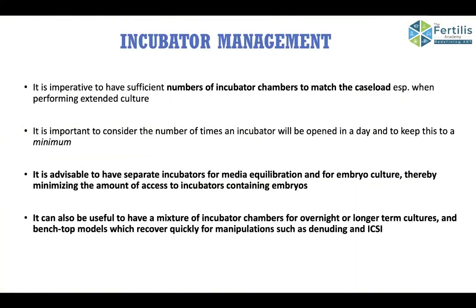When you're running a lab, you should always be very much focused on how to manage the incubators. There should be separate incubators for incubating the media, for transfers, and working incubators should be different from incubators which are used for long embryonic culture.